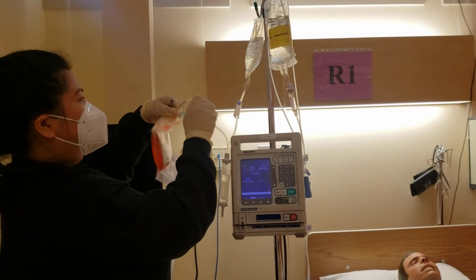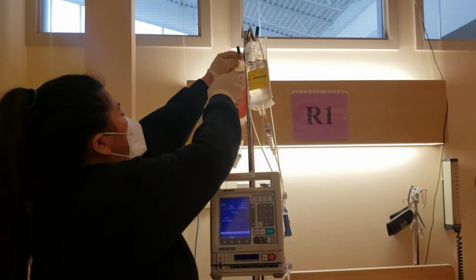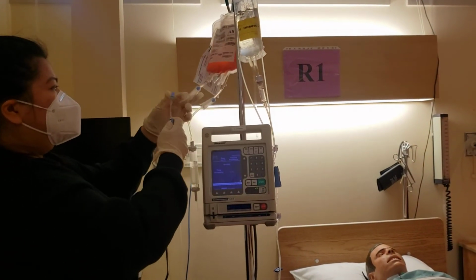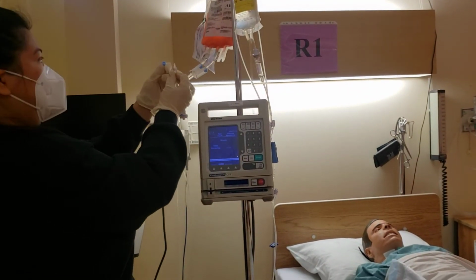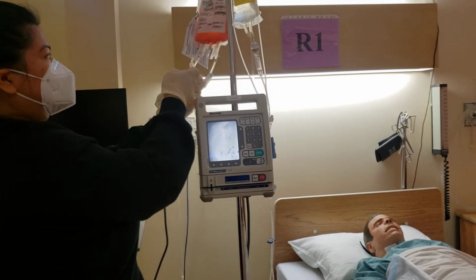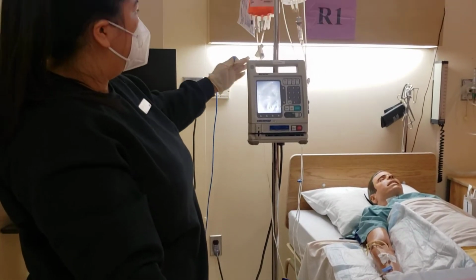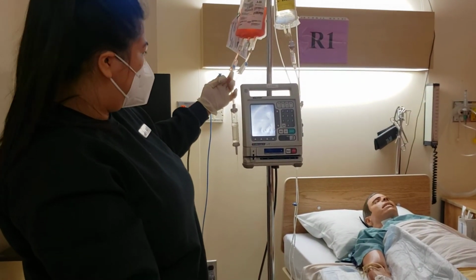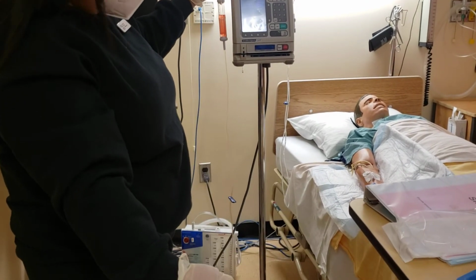Again, making sure that everything is clamped, I'm going to hang my bag. I'm going to remove the cap so we don't poke ourselves, and rotate it. After that, I'm going to open up my clamp there as well as here. Then I'll watch the blood go through the tubing and make sure the tubing is fully primed with the blood.